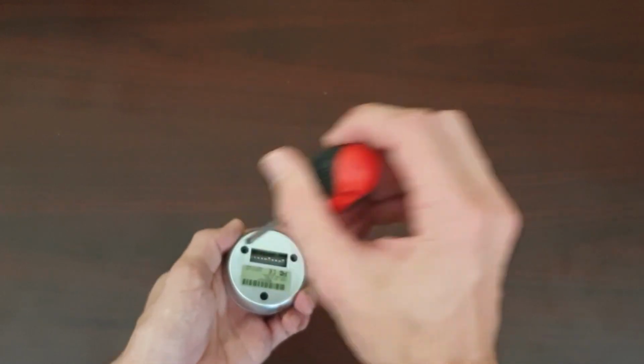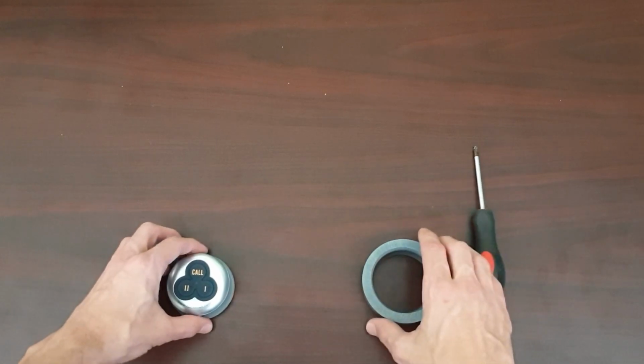The button is back together now, and you can place it back into the holder and screw it on.